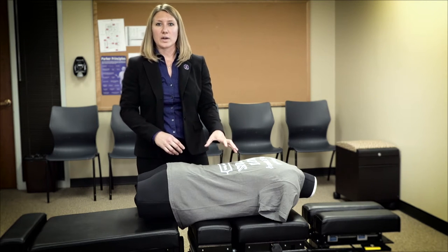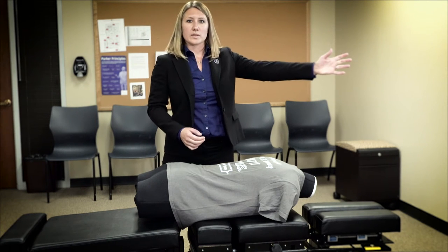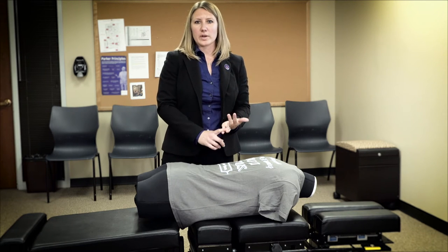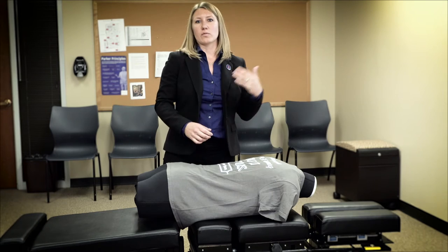What the table just did is it measured what I did, and it's going to show up on that screen right there so we can see how fast I was, how much force I put into the patient before I thrust, and then how much force it was overall with the adjustment. We're going to take a look at a graph of different outputs you can get from adjustments on this table.